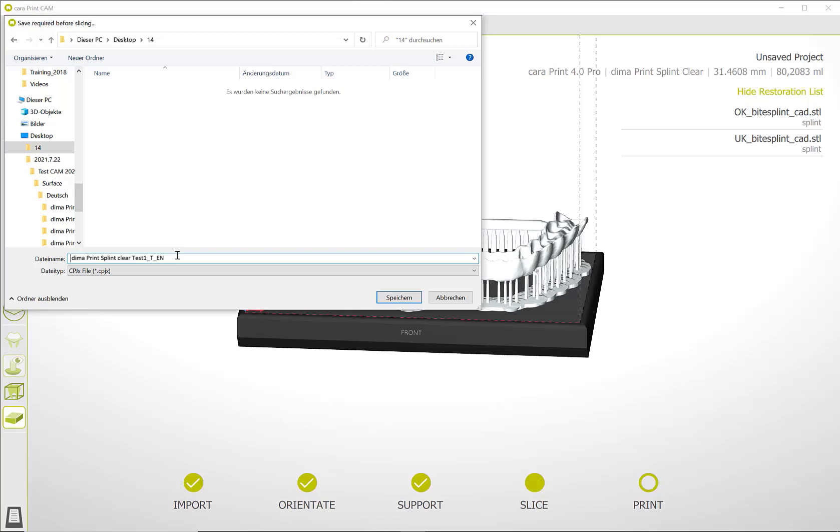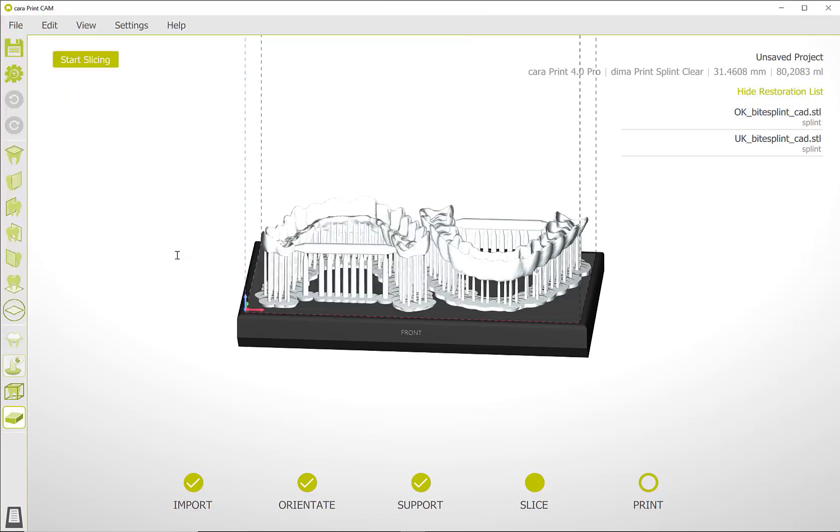You will automatically be prompted to save the project. To do this, give it a project name and select the location where you want to save it. Then the slicing process will start automatically.